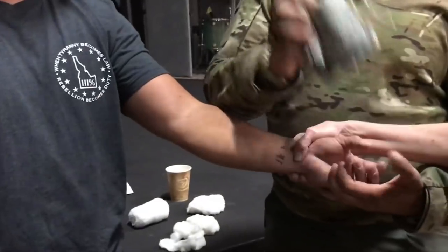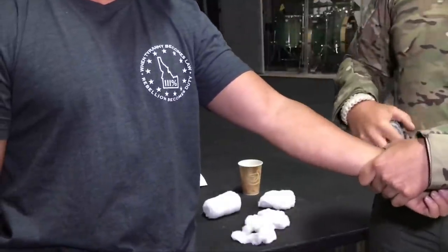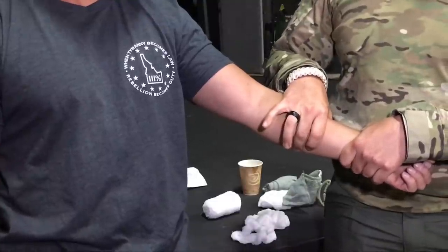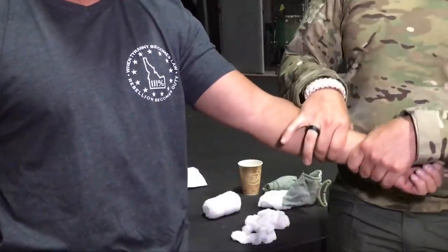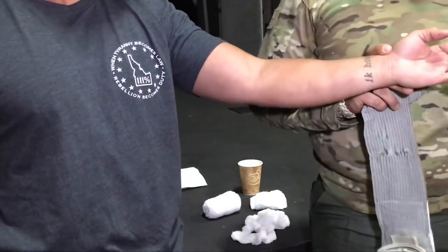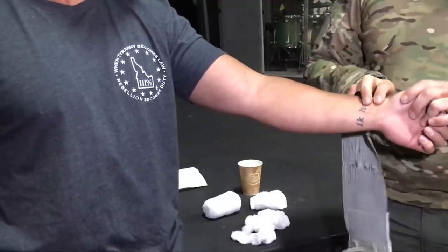With a tourniquet, I want the bleeding to completely stop. If he had a severed hand with bleeding coming out, I would want that bleeding to completely stop — tourniquet a couple inches above the wound, and if that doesn't do it, apply one higher. Always start low; if I need to address more, I go higher. With the Israeli bandage, I still want perfusion out here — this hand is good, I just have a soft tissue injury above it. So I still want blood perfusing that distal extremity and I still want to feel the pulse distally.